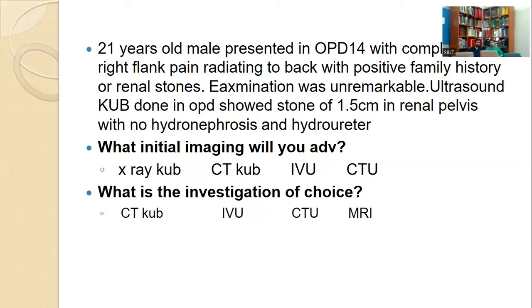Why not X-ray IVU, CT urogram, or MR urography? Stones are not well appreciated on CT urograms with contrast-enhanced studies. Dr. Fahad? Sir, the investigation of choice would be CT urogram. Is there any limitation of CT urogram? We need to know the patient's creatinine and renal function. If the patient is in renal failure secondary to stone disease, will you perform that? No. In renal failure, I will go for CT KUB. Okay.